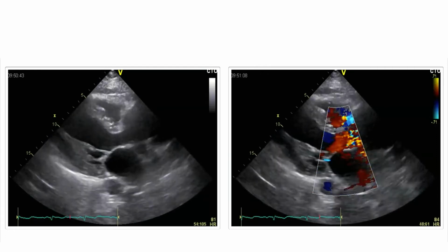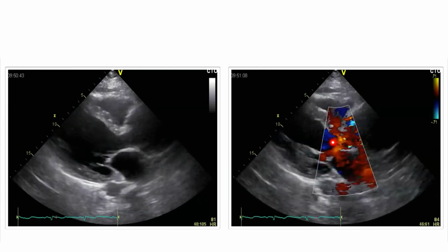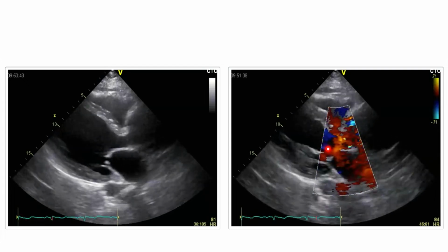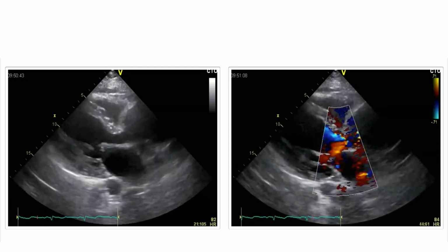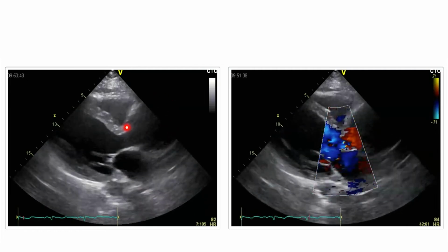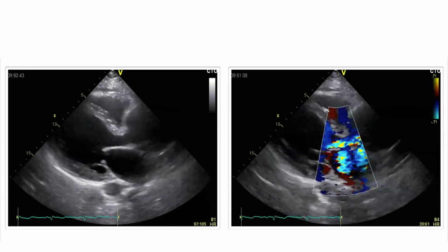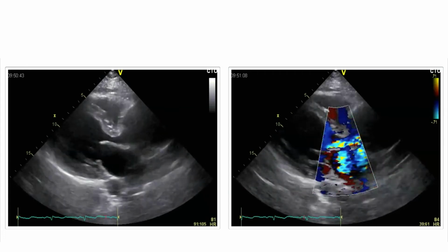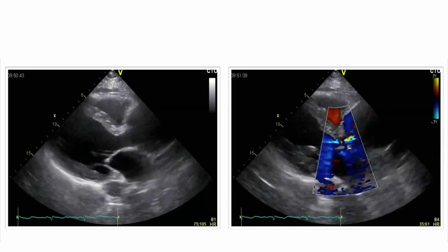Well, yes, at this point we can actually recognize the jet, which goes back into the left ventricle, and maybe from the 2-dimensional image we can also understand the mechanism behind it, because we have this really enlarged ascending aorta, and maybe this is AR associated with dilated root. Yeah, the jet is very central. We have a massively dilated aorta.